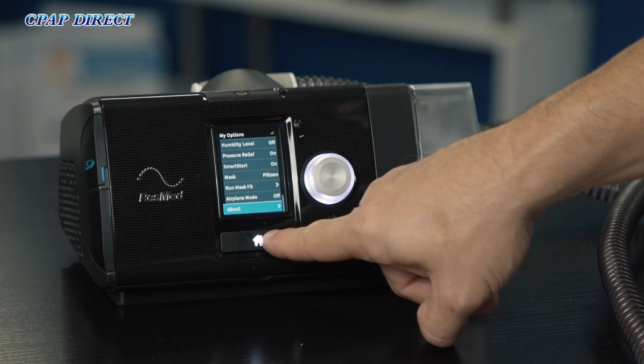The home button at the bottom of the screen goes back to the main menu. So that's all you really need to know to start using your device.